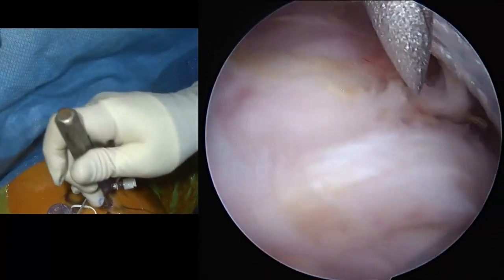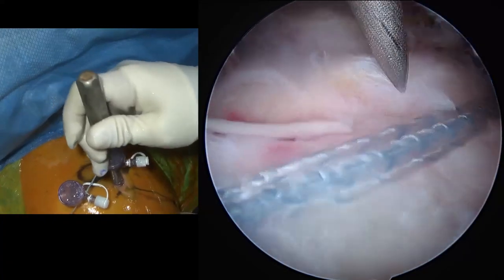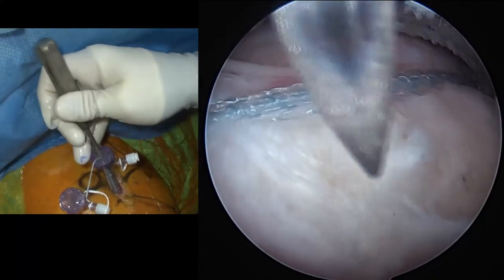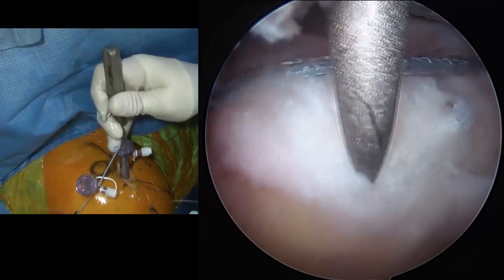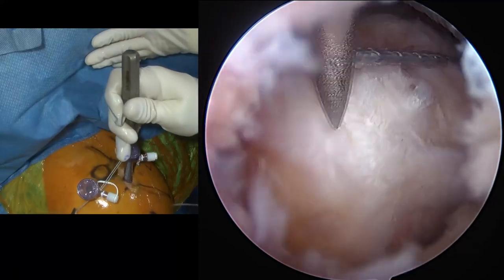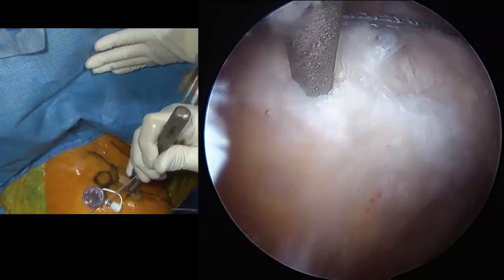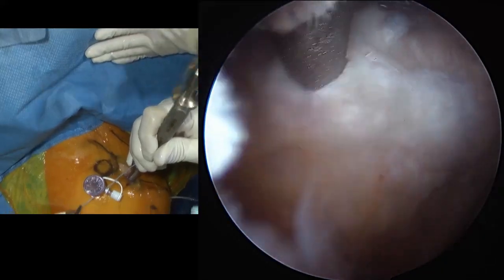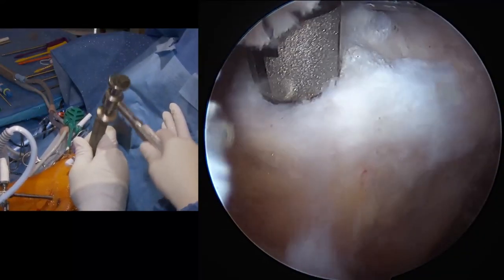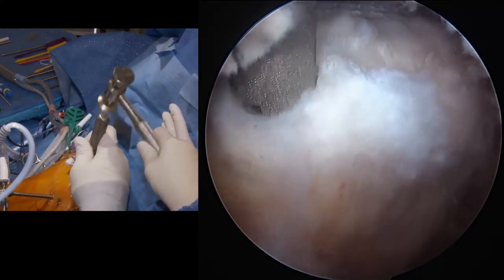So we look at the back end of the tear, which is about right here. So our blue stitch is going to come over that partially. Where's our blue stitch? It's a little further back, so we'll have to come right here. So a little bit of that diagonal I was talking about. So there's the top. There's the edge there. Okay, go ahead. Good hard bone. One more. Okay, Chris, hold that.